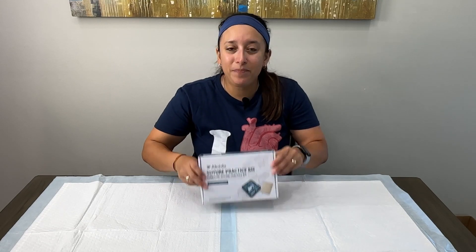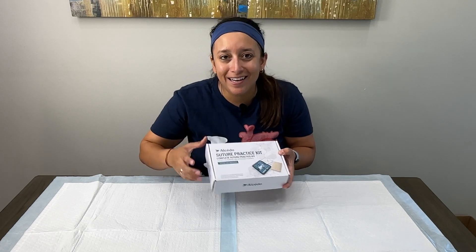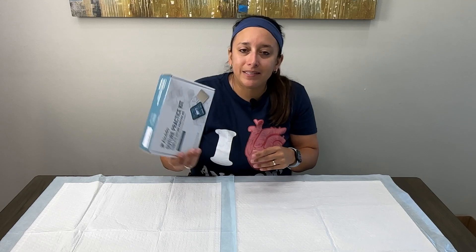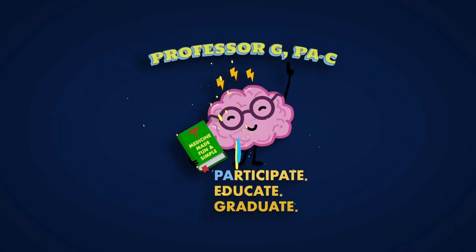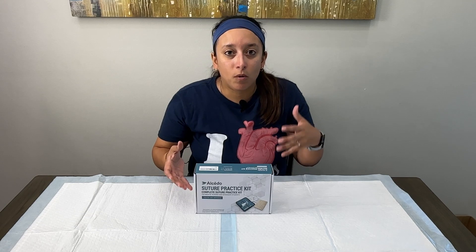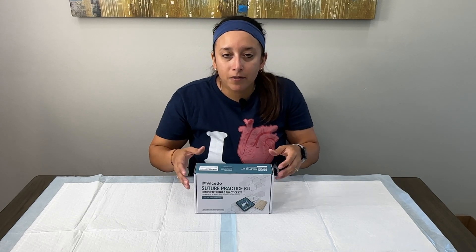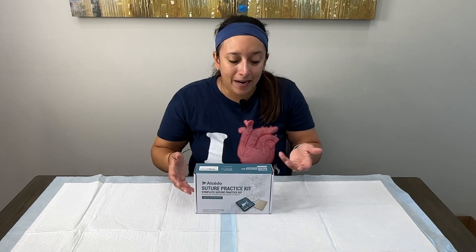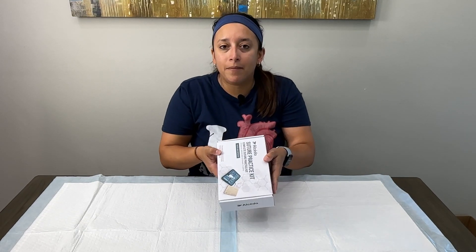Hey everyone, in today's video we're going to be covering an unboxing and review of the Alcido suture practice kit. We'll take it step by step, look inside, and see what's all included. When it comes to suture kits, there are a lot of different options on the market, and if you're a student or provider wanting to find the right kit, the Alcido kit is what we're going to look at today.